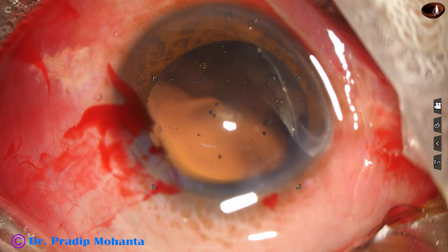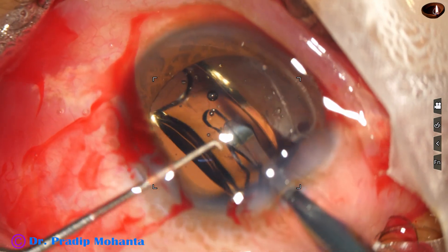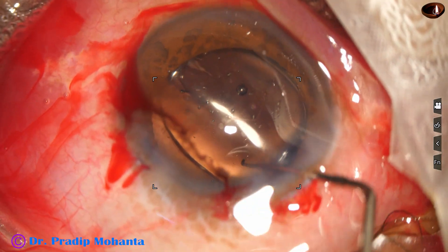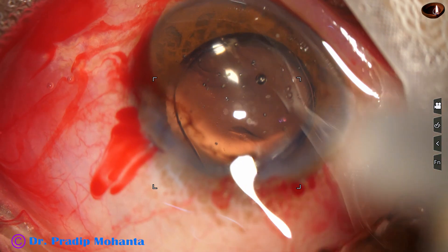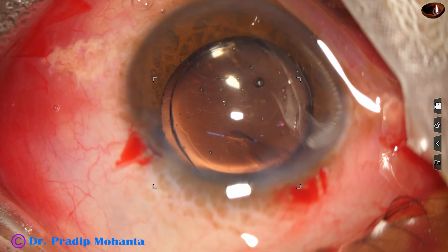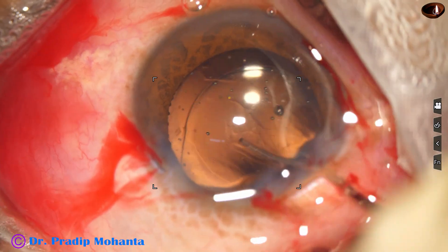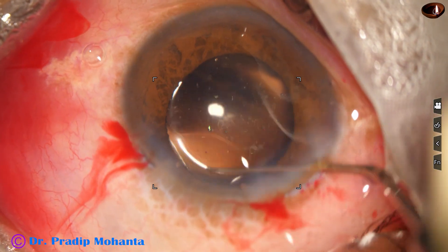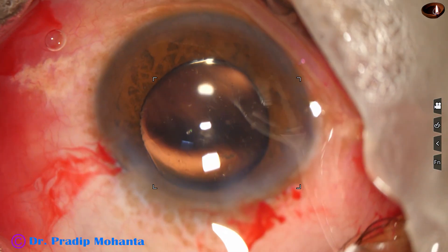The main concern is that the next day the patient should have clear cornea, quiet anterior chamber, normal intraocular pressure, and good vision. This is a hydrophobic single-piece monofocal aspheric intraocular lens from Appasamy Associates — Superphob, a beautiful lens. The lens is in the bag. I am rotating the lens and checking that the other haptic is also in the bag, because the rhexis margin on the other side is not seen. I rotate, bring the other haptic to 6 o'clock, and confirm that the other haptic is also under the anterior capsular rim — so the whole lens is in the capsular bag.